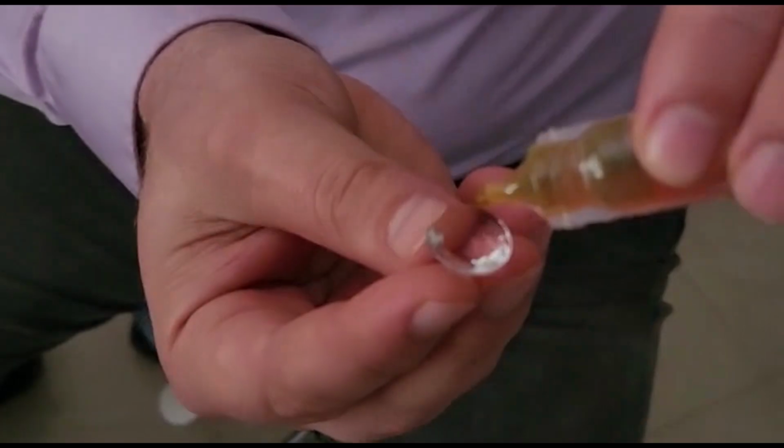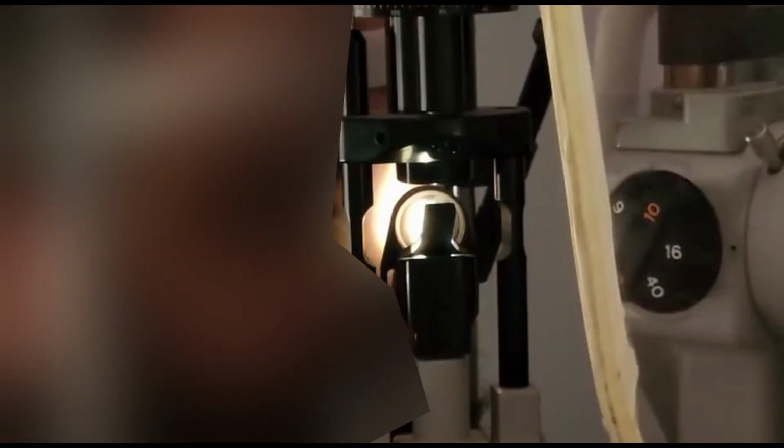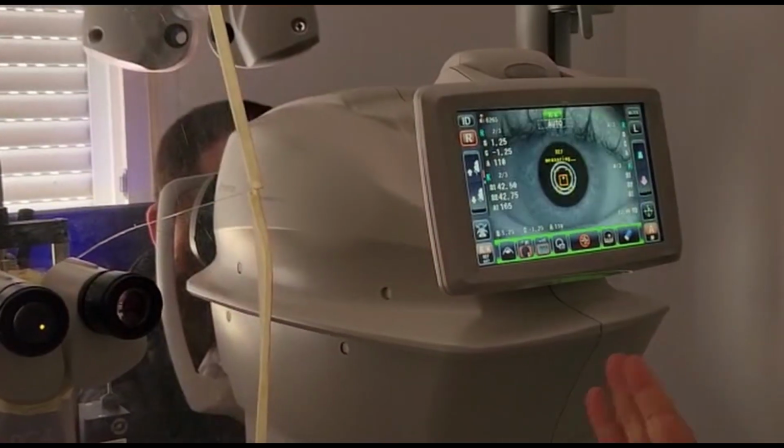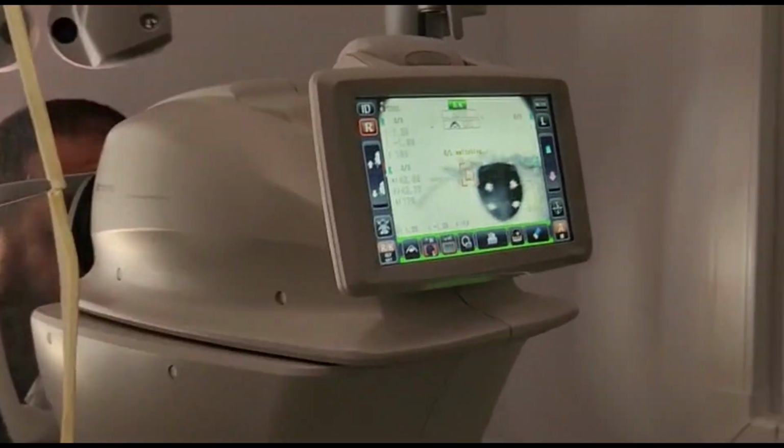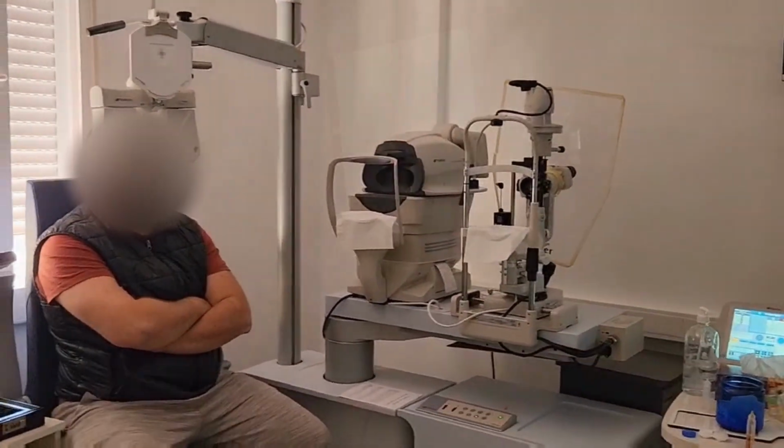Visual acuity is 0.5 under his old scleral lens, but there is a pericentral touch as seen in fluorescein images used in slit lamps. If it persists for 1 month, the scleral lens fit should be changed for a higher vault. Sutures would be removed after 1 month with the stop of eye drops.